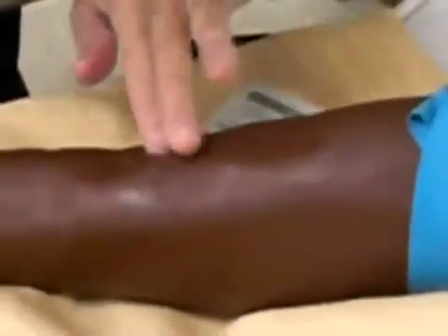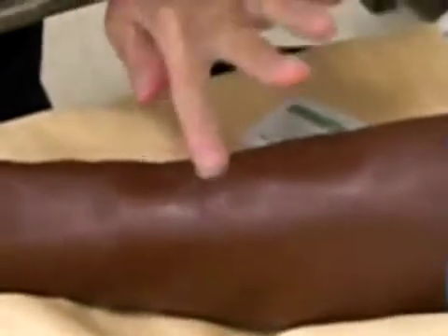The nurse uses her index finger to palpate the vein by pressing downward and noting the bouncy feeling as pressure is released. Then the site is cleansed with an alcohol swab and allowed to dry, and then cleansed again with betadine or iodine.